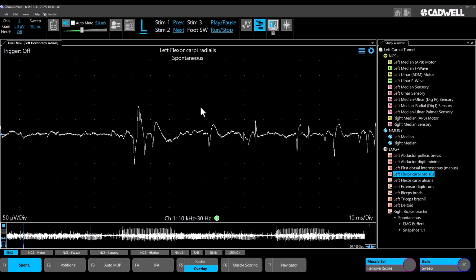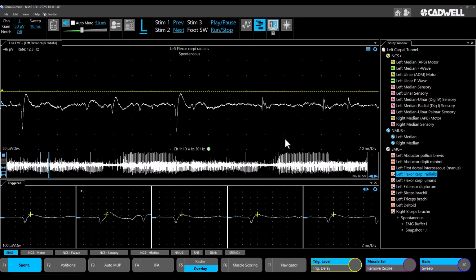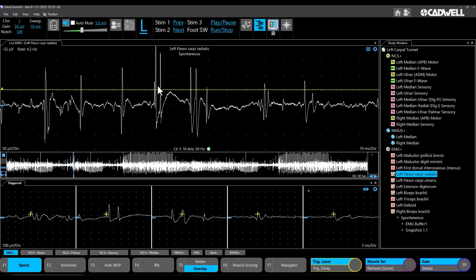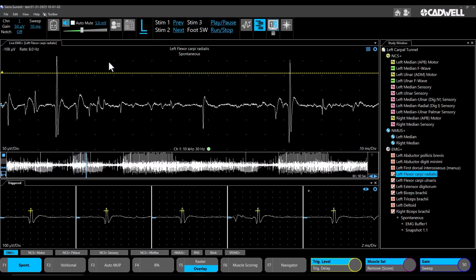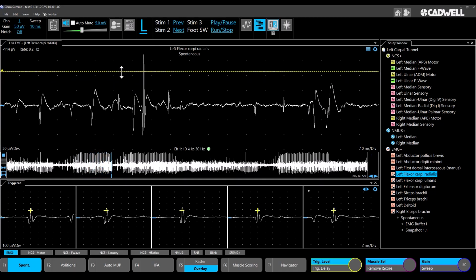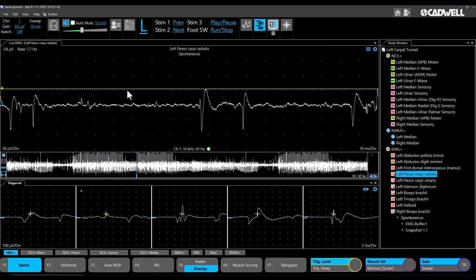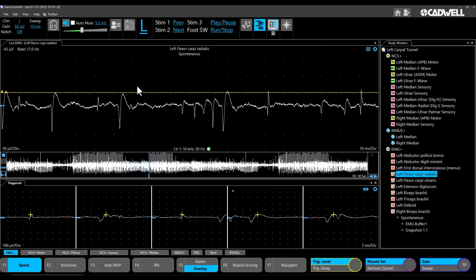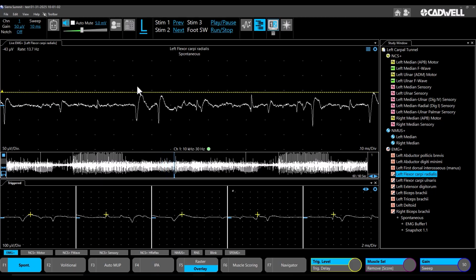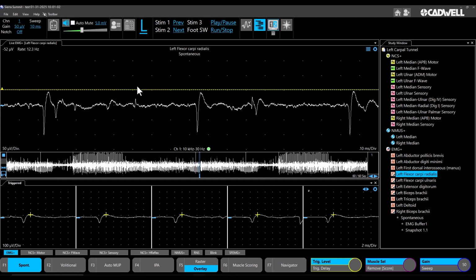And if you push view, the second view has a live EMG Plus window, as well as a triggered traces window and a trigger enabled. The trigger is actually enabled as an auto trigger, so it's automatically adjusting to trigger on the largest unit firing. At any point you can toggle back and forth between those 2 views. The 2 views can be set up with different windows and workspaces, or they can be set up the same but with just different gains and sweeps in your trace window.